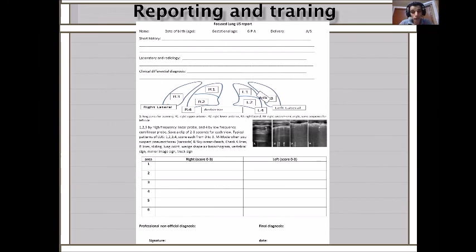And remember, we're talking about point of care ultrasound, focused ultrasound, or ultrasound done by non-radiologists. So it follows a certain protocol. As you see, we have areas to scan. You don't do any ultrasound you like, and you should report to somebody who can supervise you and correlate it. And it's an ultrasound done by a frontline physician. So if you are interested, I hope that you can spread the news, and that would be great. And join more people. I can repeat, but also I have very good software.